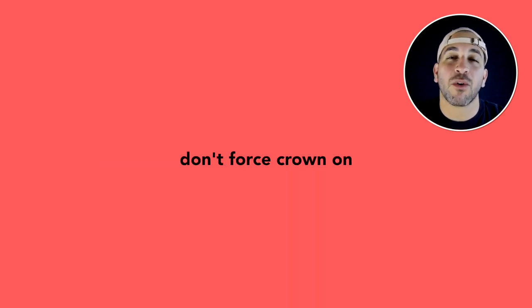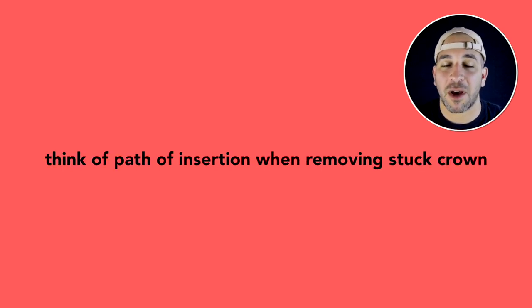One other important point: when you try on the crown, don't force it on. Sometimes you'll put the crown on, snap it into place, and then it's really hard to get the crown back off. You can use a scaler or other tools to wiggle it back off, but that's why you don't want to force anything into the mouth — so be careful with that as well.